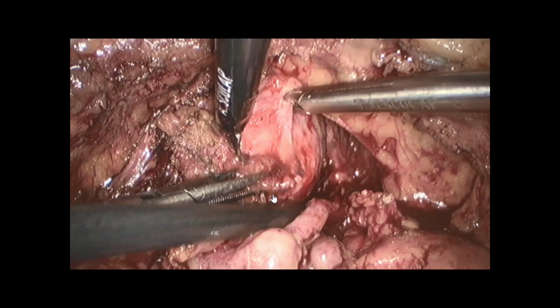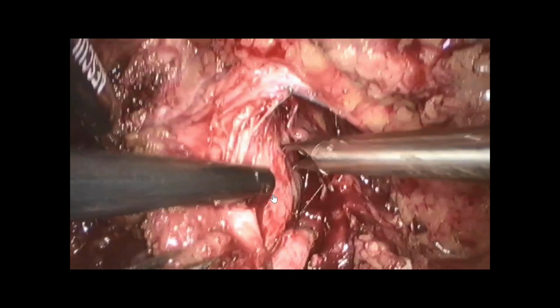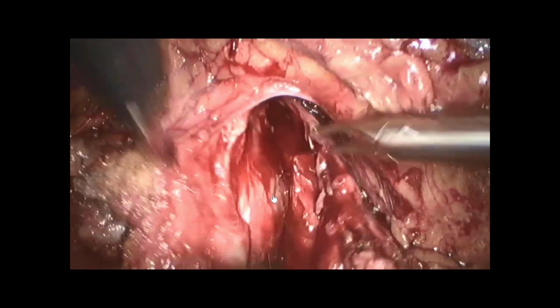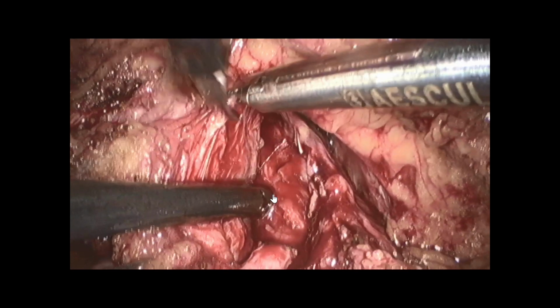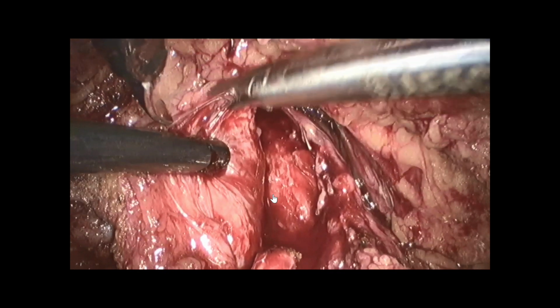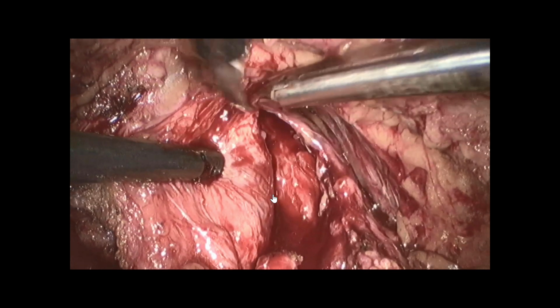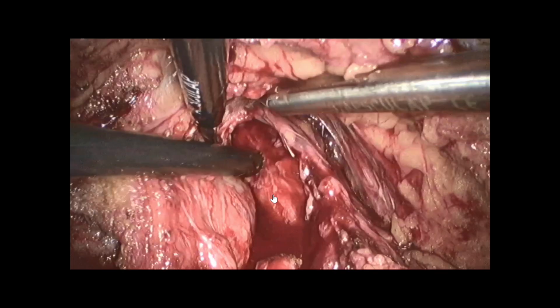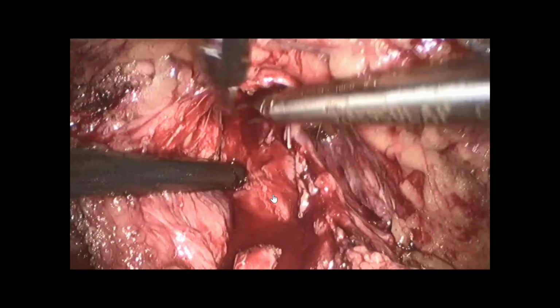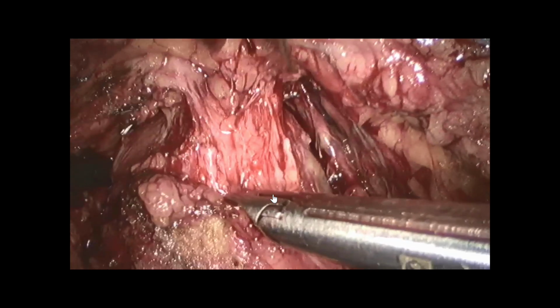You see that now I'm coming very high, and slowly we dissect, try to spare as much as possible. You see the bundles, slowly the bundles are going far away, and really no cautery, you just cut and pull down. You see, clip, small clip, and you push. And then slowly you see that the bundles are going far away from the urethra.